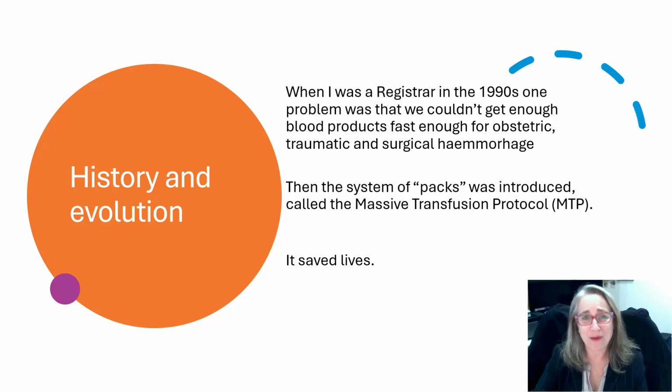So when I was a registrar back in the 1990s, one problem was that we couldn't get enough blood fast enough for obstetric, traumatic, surgical haemorrhage. It was really a difficult time, and then the system of packs was introduced, and it really did save lives. We called it the Massive Transfusion Protocol, and things got better. But since then, more technology has become available. And so how do we define viscoelastic haemostatic assays?